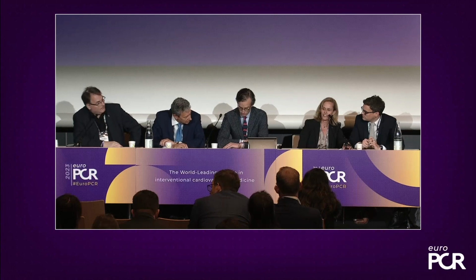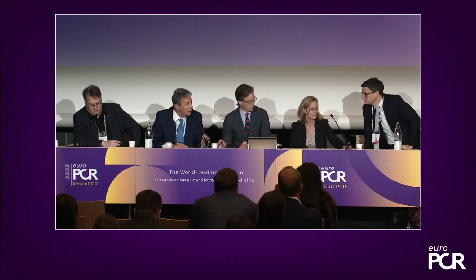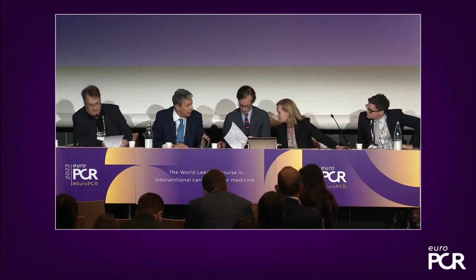Sergio, I know you have a lot of experience. So what do you think about the learning curve? If I want to introduce it into my daily cath lab practice, how long does it take to really be confident to use an ICE probe? It depends on your background, and it depends on the kind of procedure. If you have a good experience with the 2D ICE, probably 4 or 5 cases for tricuspid is enough. I have no clear idea for the mitral, because the quality of the TOE imaging is very, very nice, so I'm not sure that TOE will be replaced for the mitral.